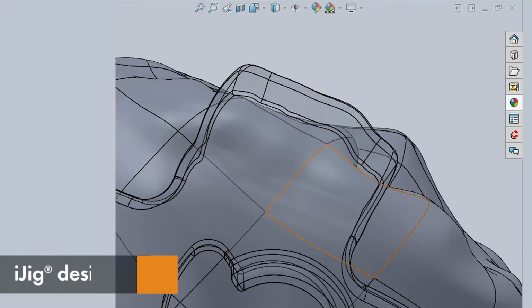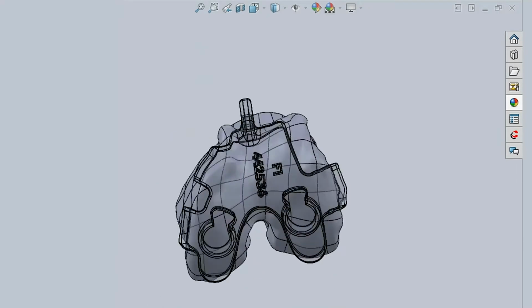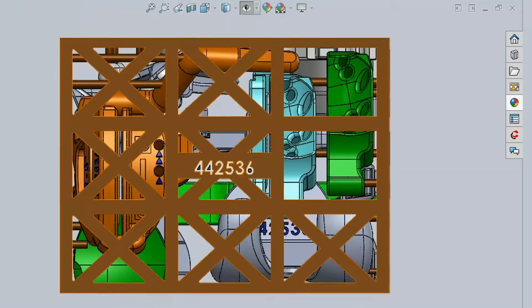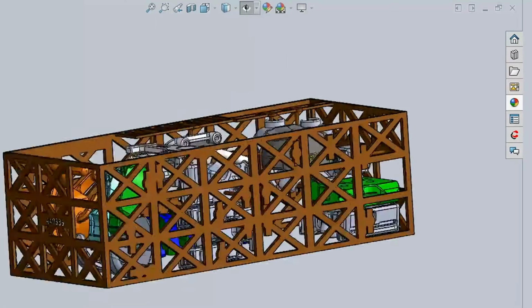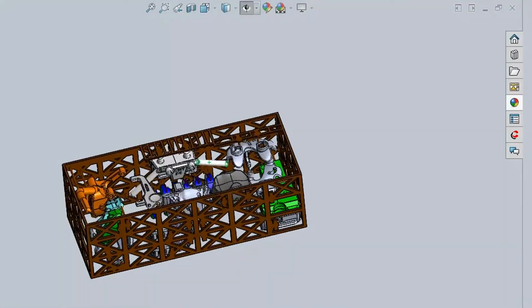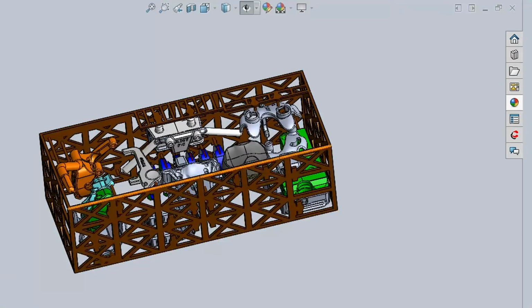While many companies have patient-specific instrumentation, our jigs are unique in that they facilitate the accurate placement of our patient-specific implants. After the jigs have been designed, they're compiled into our print frame, which is manufactured here in-house using 3D printers. And once the jigs have been printed, they're broken out of the print frame, cleaned, packaged, sterilized, and delivered for surgery.